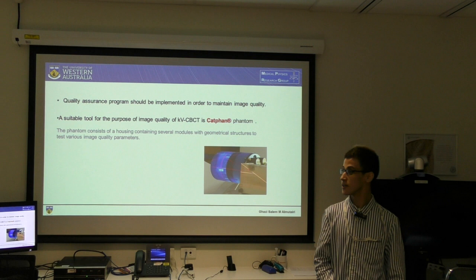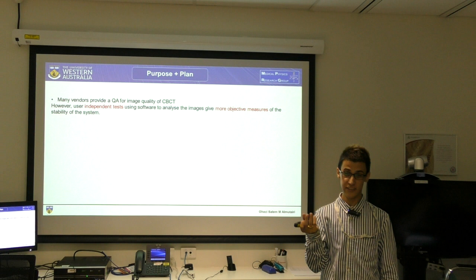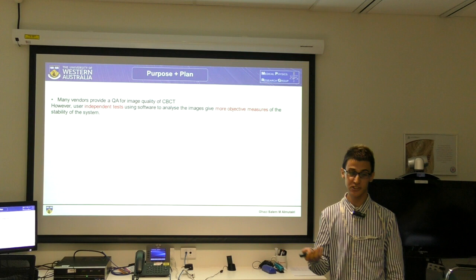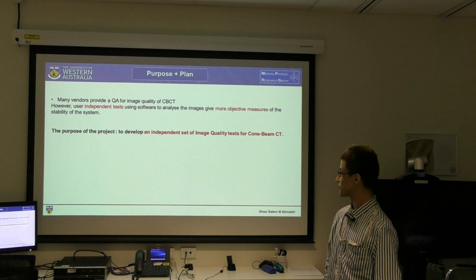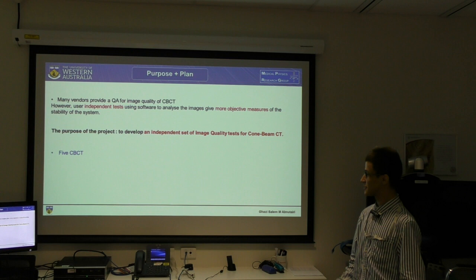So the purpose and the plan. Many vendors provide quality assurance for the KV-CBCT, but user independent tests using software to analyze the quality of the image give us more objective measurements of the stability of the system. So the aim of the project is to develop an independent set of image quality tests for cone beam CT. I will be using 5 CBCT, the Catphan and MATLAB to develop the algorithm.